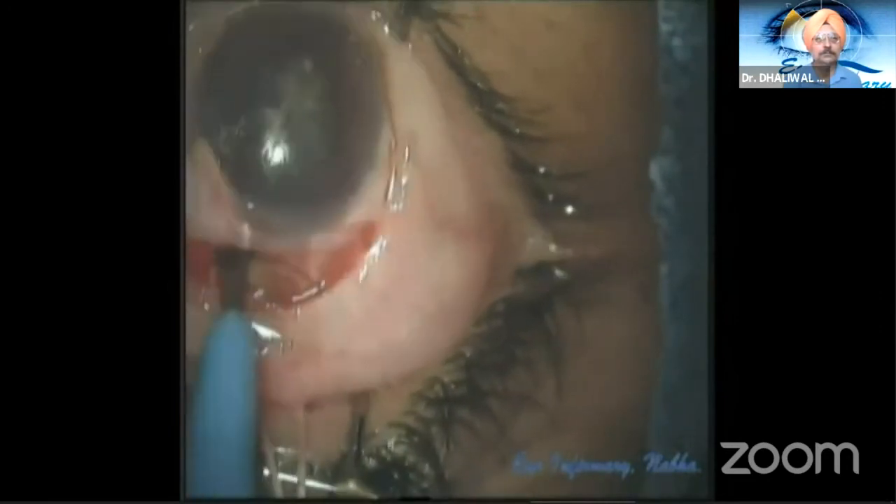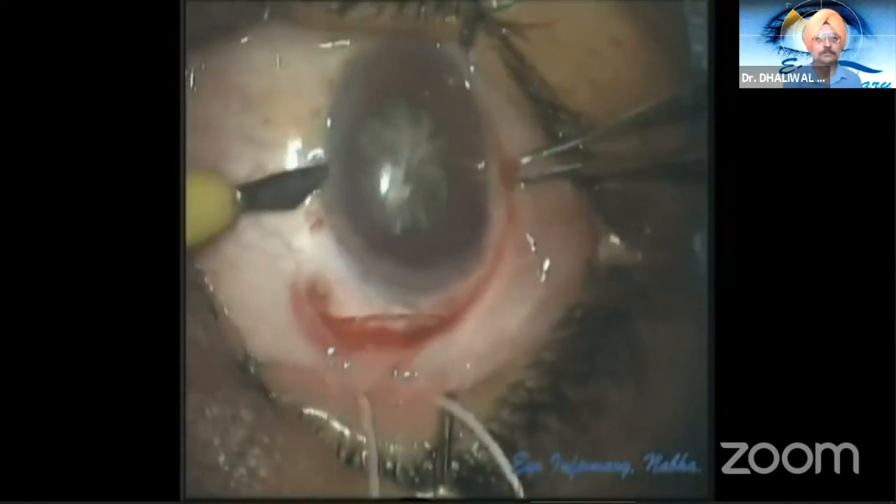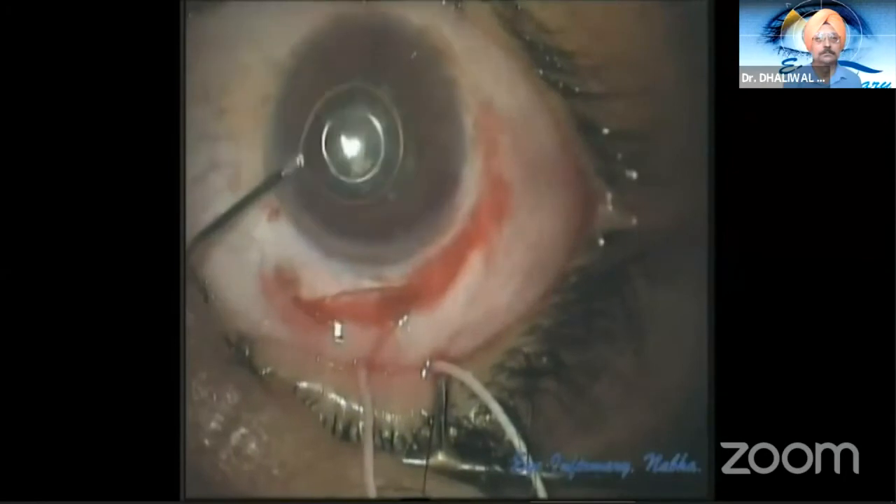A corneal scleral tunnel is made with a crescent blade, and a side port is made with a 15-degree knife.